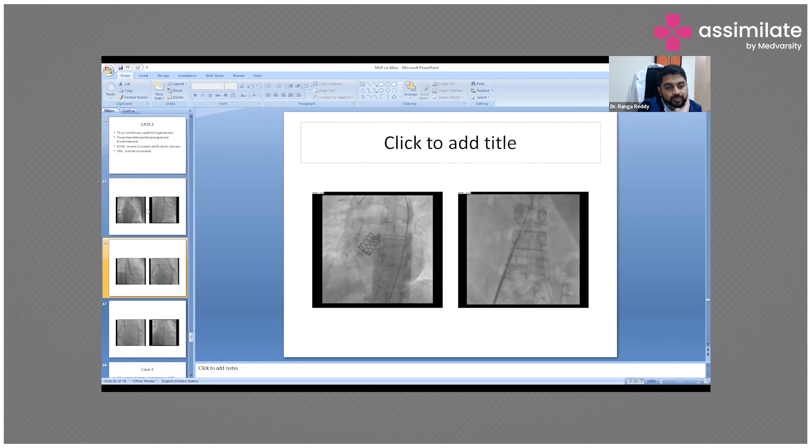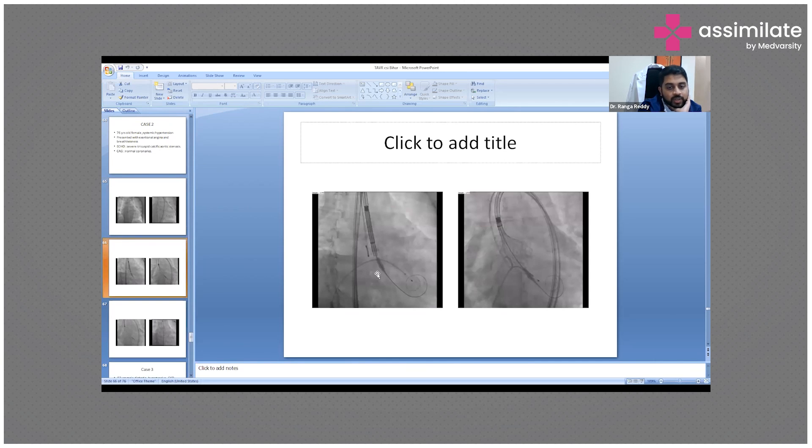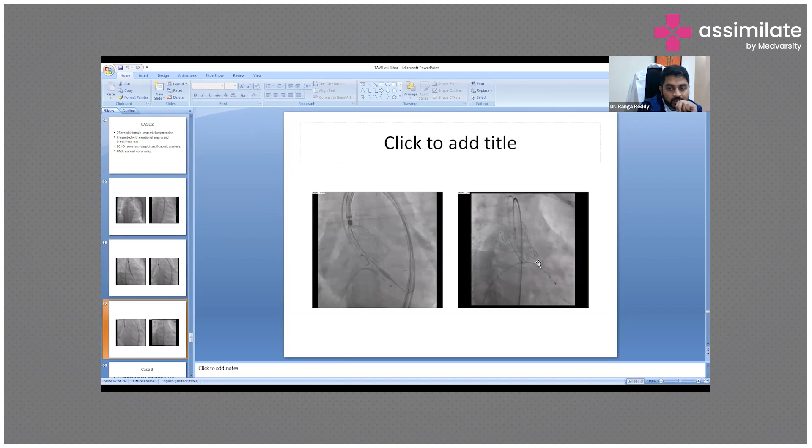This is another case. You can see the heart, the arch of the aorta, a pigtail catheter, and the wire. We crossed it and placed a temporary pacemaker in the right ventricle. The wire passed is a very stiff wire kept in the left ventricle. This is a self-expandable valve being expanded here — it's not fully expanded yet. With this type, we can recapture and re-align up to three times, which is a unique facility of self-expandable valves.